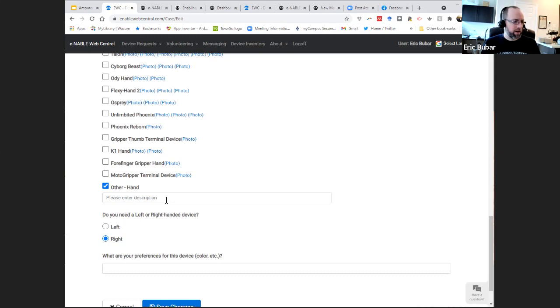How is a 3D printed arm able to be used in real life? I've made devices for kids a lot. This is a question from Marianne. How is a 3D printed arm able to be used in real life? I found that it's a fist bump device, first and foremost, for kids. Whenever I make a device for a child, the first thing they do is they fist bump.